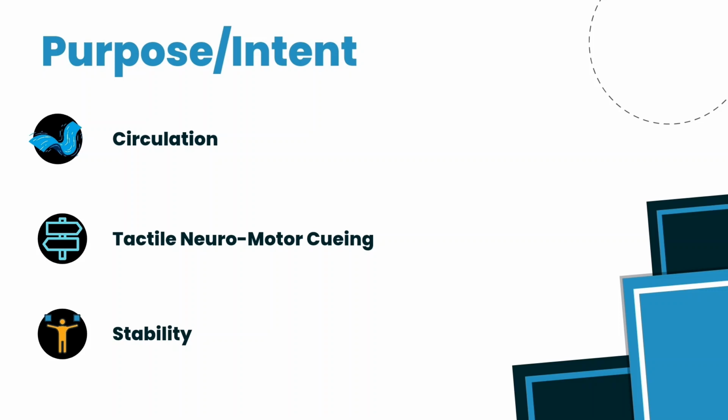So when you stabilize with K-tape, it's not going to be super stable. So you don't want to use this on something that has to be 100% stabilized, otherwise you can't walk on it, or it needs to be stabilized, otherwise you can't use it. This is for gentle stabilization. The other thing is, I find that the stabilization is so gentle that it's actually best for just some mental cueing, or again the neuromotor tactile cueing for that region to maintain stability.